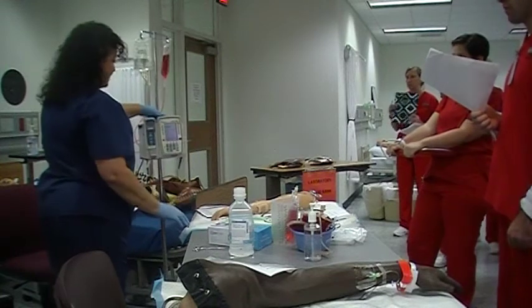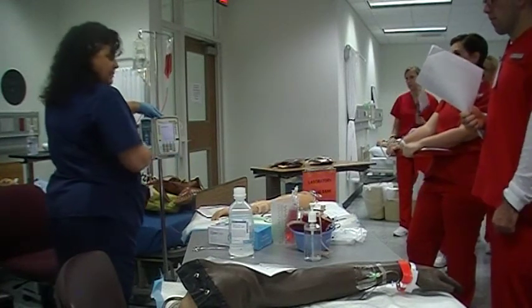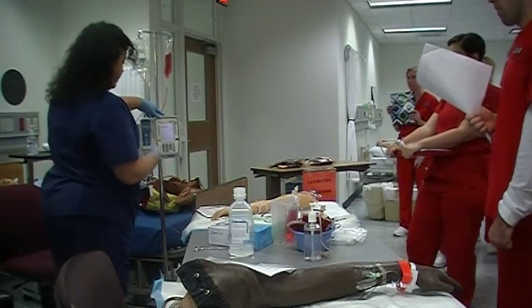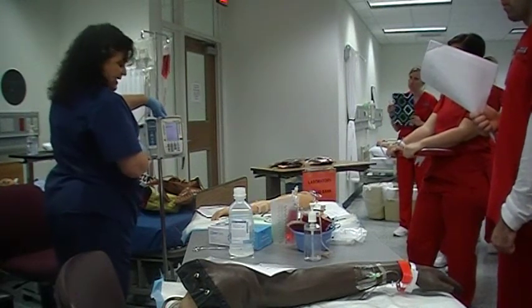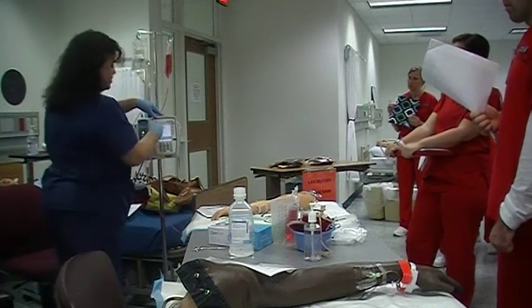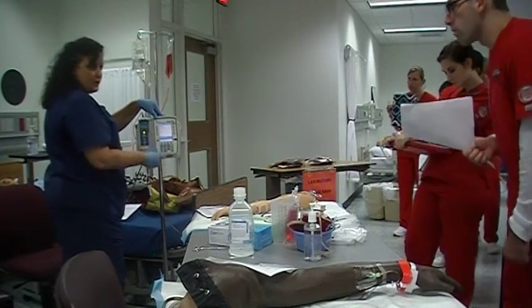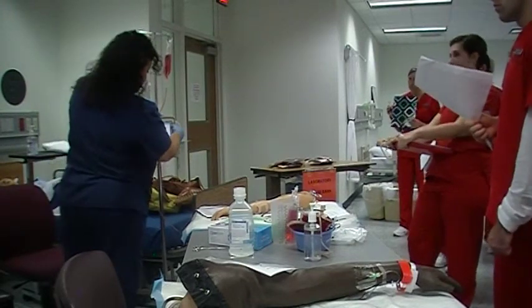The first question it asks you, is this a new patient? Okay, so if it was in the room with the patient and it's his pump, you could just say no. And let's pretend that that's the case here. So it's still med-surg. It has some options, med-surg, critical care. So this was programmed for med-surg. We're going to say yes.